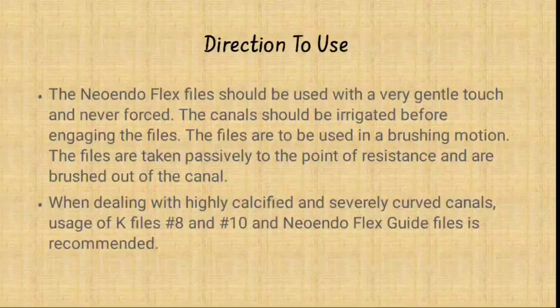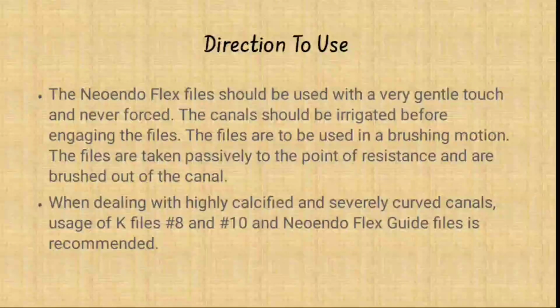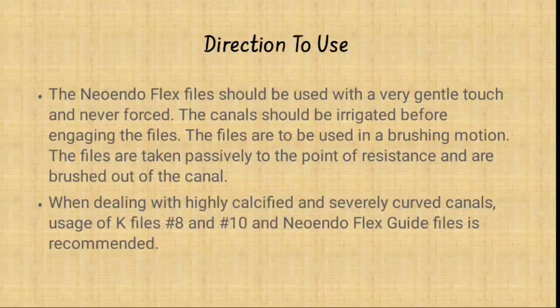Next we have the directions to use. The NEOENDO flex files should be used with a very gentle touch and never forced. The canals should be irrigated before engaging the files. The files are to be used in a brushing motion. The files are taken passively to the point of resistance and are brushed out of the canal. When you feel resistance, you take the file out.